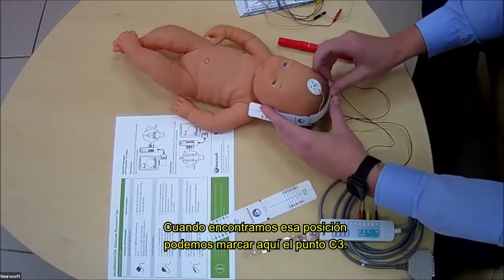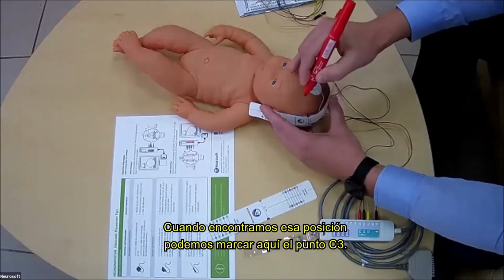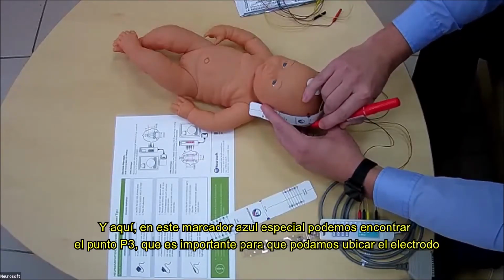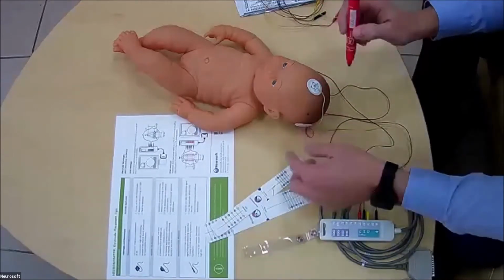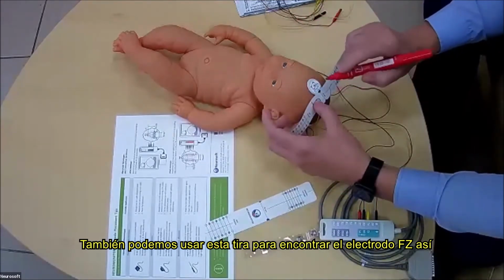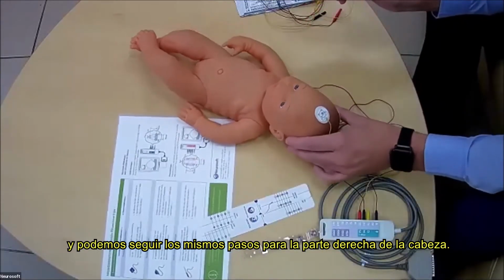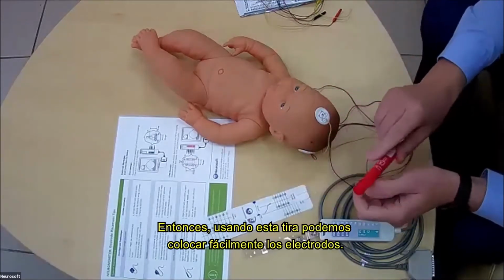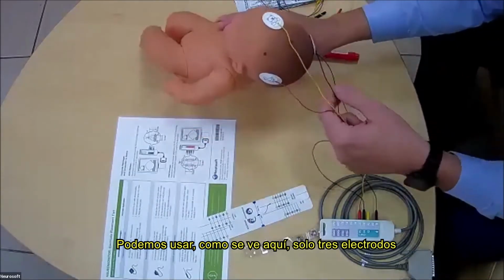When we find this position, we can check. We can set the C3 point here, and on this special blue marker, we can find the P3 point, which is interesting for us to put the electrode. So we can put it here, and also we can measure it. We can use this strip to find the PZ electrode like this, and do the same operations for the right side of the head.